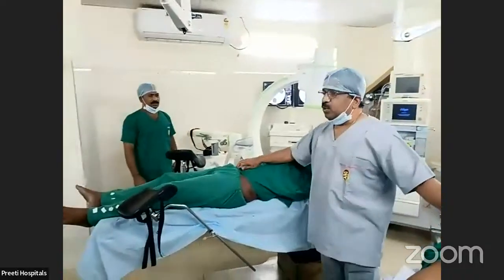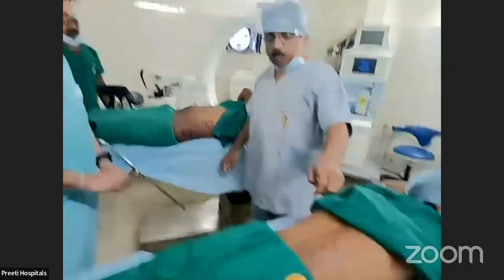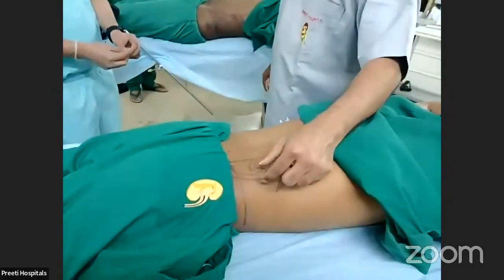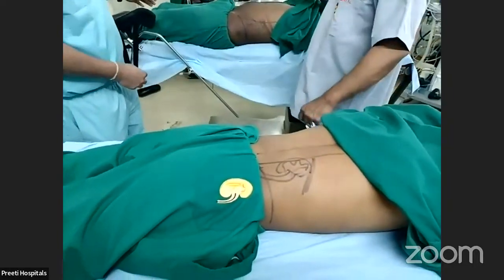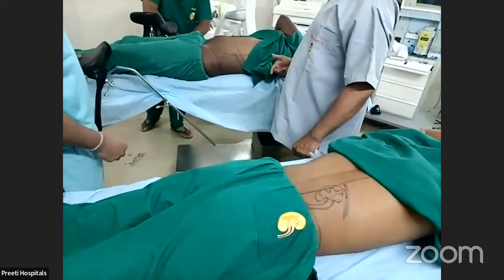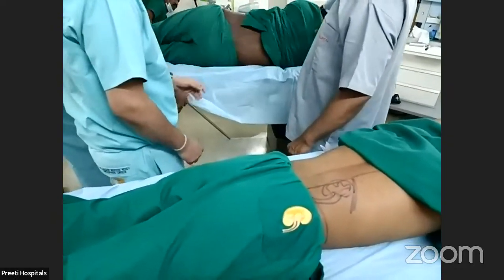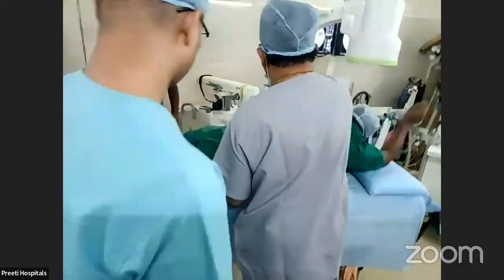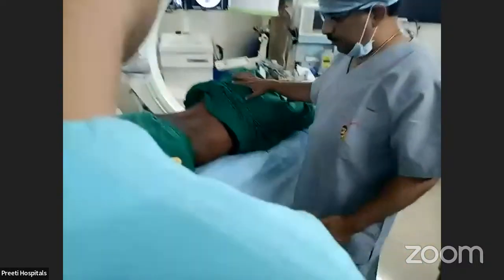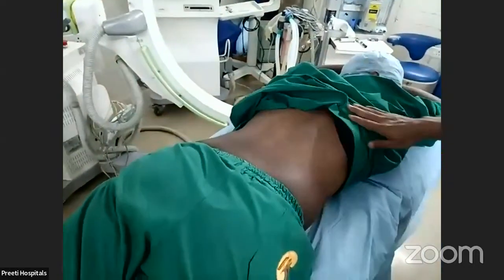One more thing I wanted to ask you, a very important question, a lot of people ask. In prone PCNL, this C-arm is there. Now take this out. It is important. Turn back. Come back. Now, in the C-arm, you will not do much, don't worry.